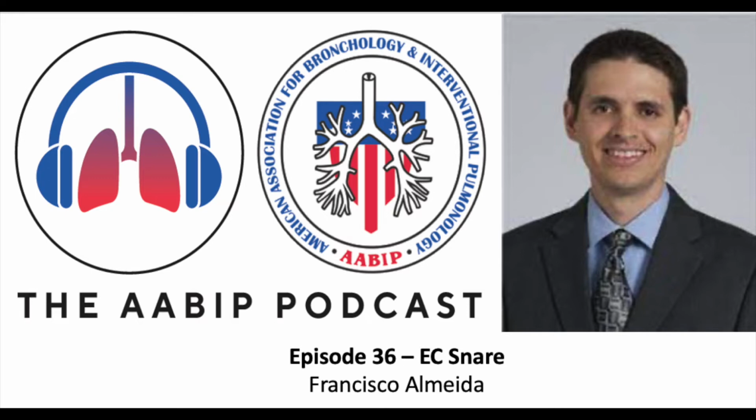Right. It's funny you say that. I recently had a case where I think I had every single tool available out. And the staff was asking me if I need anything else, because I think there was nothing left, from the APC to the snare to the Bowie. And as you said, we go through multiple of them and see what works. So as you mentioned about the coagulation, when you're using a snare, I use one of the RB devices and there's a cut option, there's the Coag option. So when do you choose one versus the other, if you think that this lesion is the right lesion to use an electrocautery snare per se?